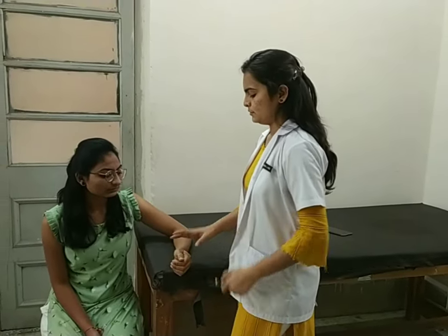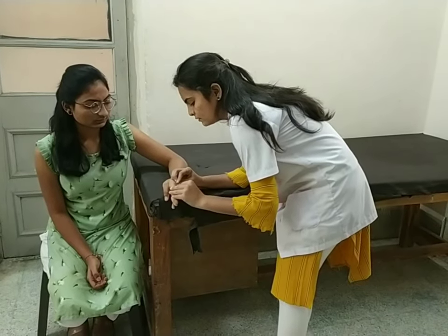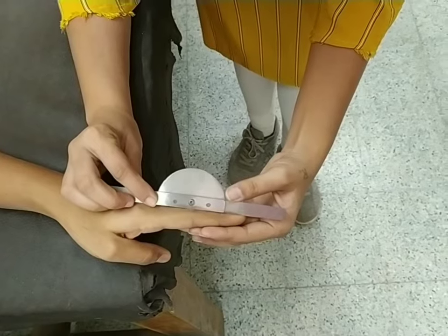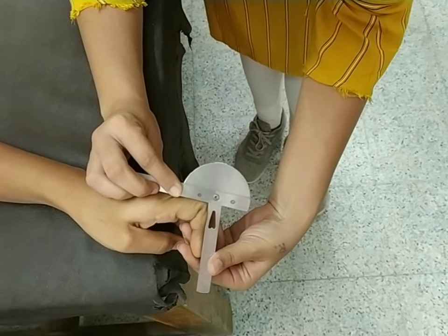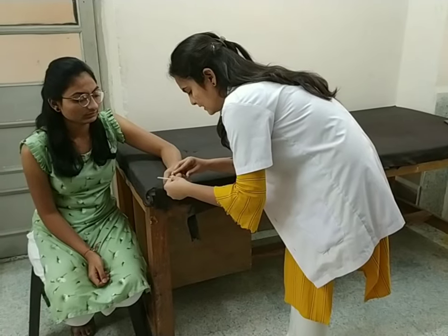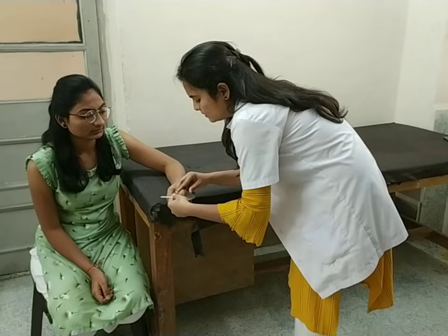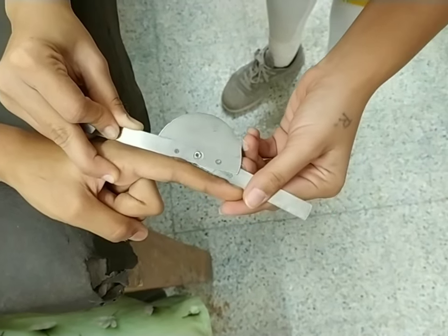For proximal interphalangeal joint flexion and extension, position of the patient sitting on a chair with forearm and palm fully resting. Fulcrum over the dorsal aspect of the proximal interphalangeal joint. Position of the stable arm over the midline of the proximal phalanx and moveable arm over the midline of the middle phalanx. Ask the patient to bend your finger towards your palm, then take your finger away from your palm. Normal range of interphalangeal flexion and extension is noted.